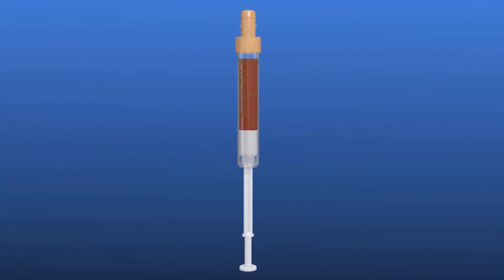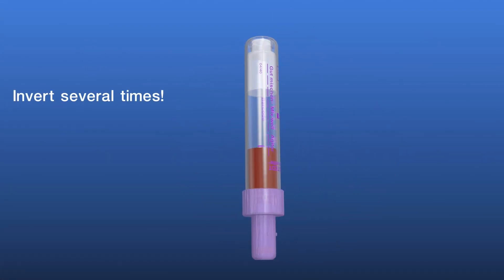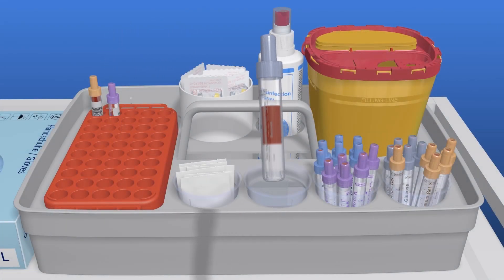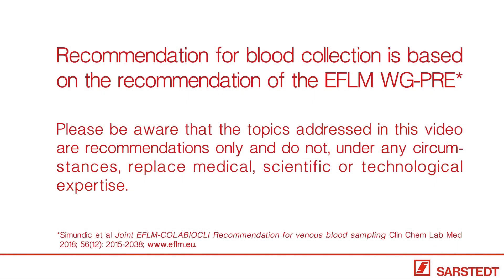Pull the plunger of the first S. Monovet all the way to the end until it audibly clicks into place, then break it off. Store the correctly labelled sample upright. To avoid the blood clotting, invert each S. Monovet individually or altogether several times. For optimal coagulation of the S. Monovet serum after collection, store these standing upright.